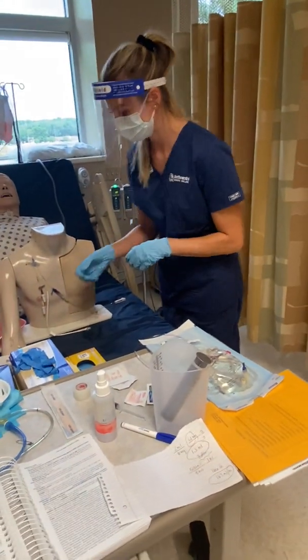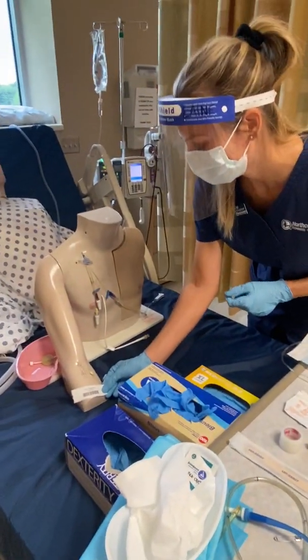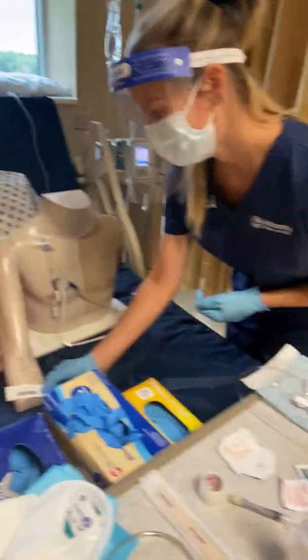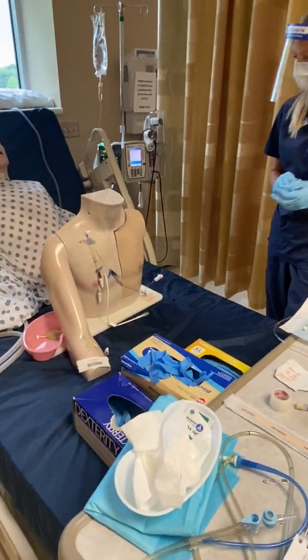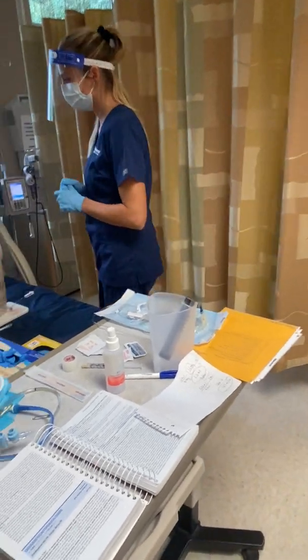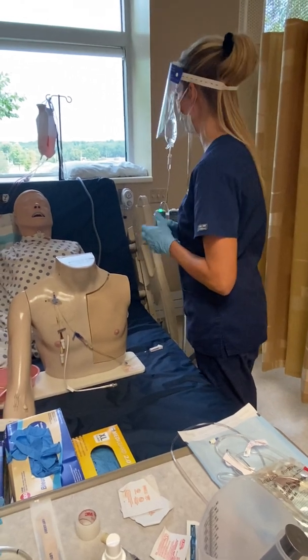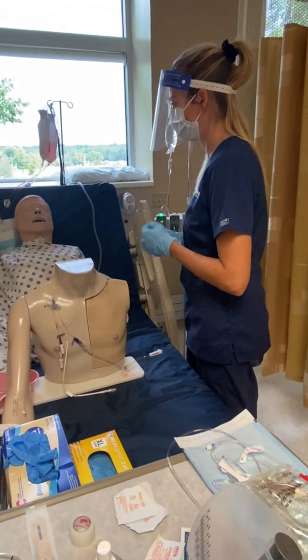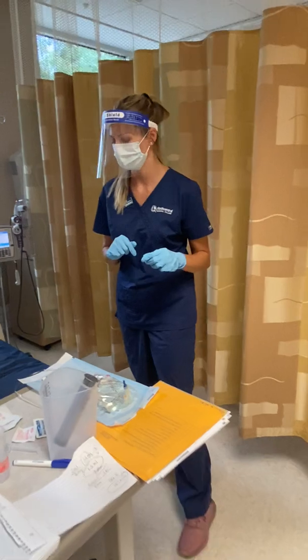Okay, so I'm just going to check your name and date of birth, Jane. You can verify your first and last name and your date of birth. Jane Dickinson. And 32433. Okay, thanks, Jane. All right, so I'm just going to close this up here. The first thing that I'm going to do is get an IV bolus of normal saline running for you to try to get your blood pressure back up, okay? I'm going to get that all set up for you.